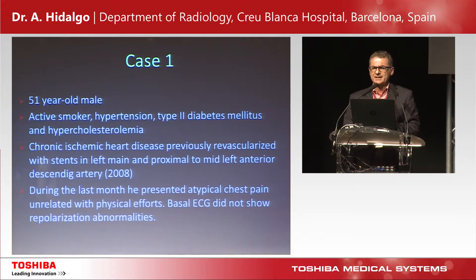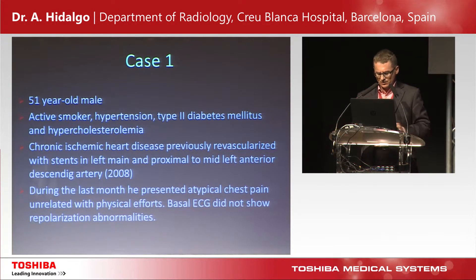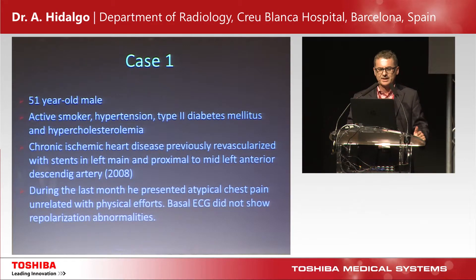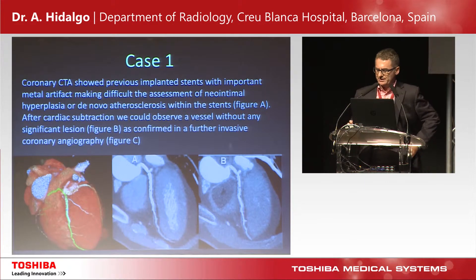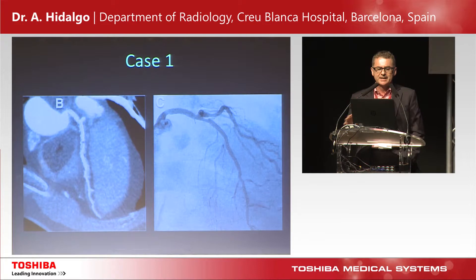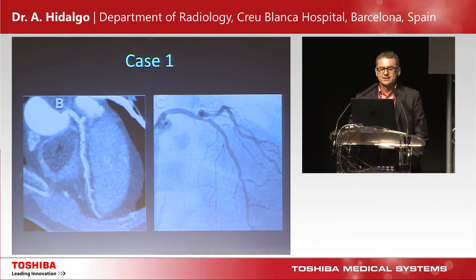The first case is a 51-year-old male, an active smoker with hypertension. He had chronic ischemic heart disease that was previously revascularized, and during the last month he presented with atypical chest pain. The resting ECG did not show repolarization abnormalities. On the CTA, you can see the stent, and it is difficult to evaluate whether there is neointimal hyperplasia. On the subtracted images, and when comparing with invasive coronary angiography, you can confirm there is no significant lesion in this vessel.